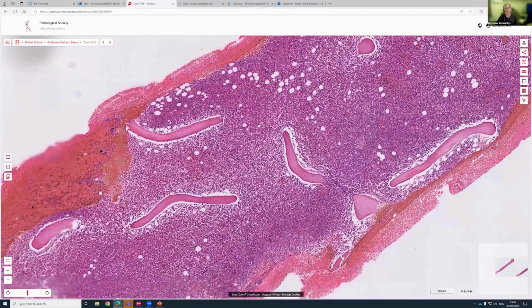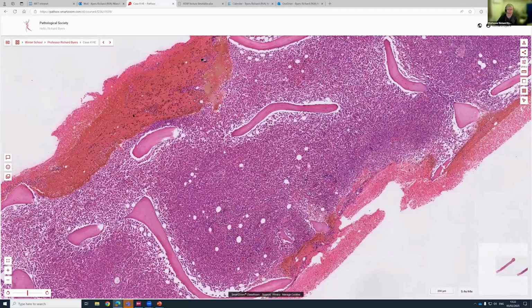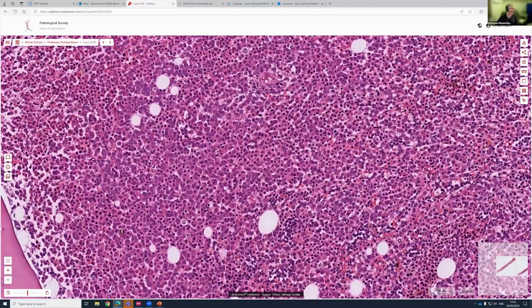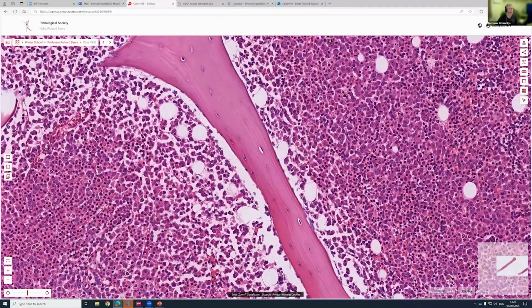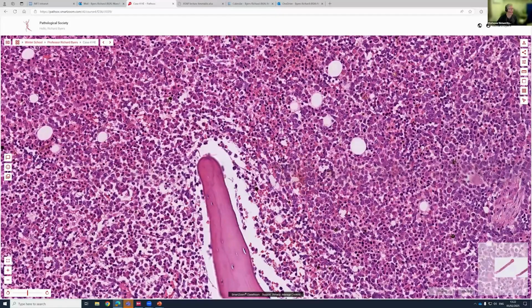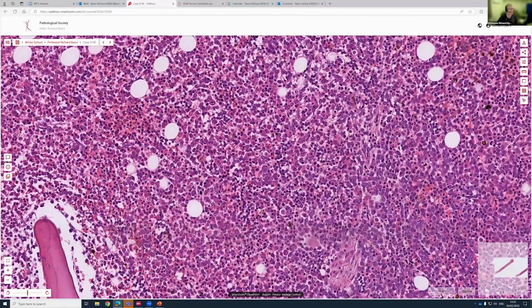The only other instance where all the cells are the same is in an area, but then you've got some normal hematopoiesis elsewhere, and that's what you'd see in a lymphoma. But an acute leukemia will pretty much fill the entire marrow, and certainly one that you get in the exam, you'd see the same cells everywhere you look, the same in all directions. The main cell that might persist in this onslaught from a proliferative collection of blasts is the megakaryocytes.